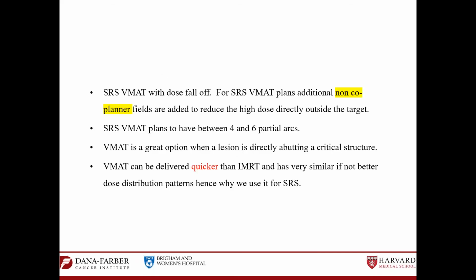Now, to get a very good dose fall off and to protect the organs at risk around the lesion, we have the choice in VMAT to use non-coplanar fields, meaning you can move the couch. So you will have beams from different arcs, from different angles.